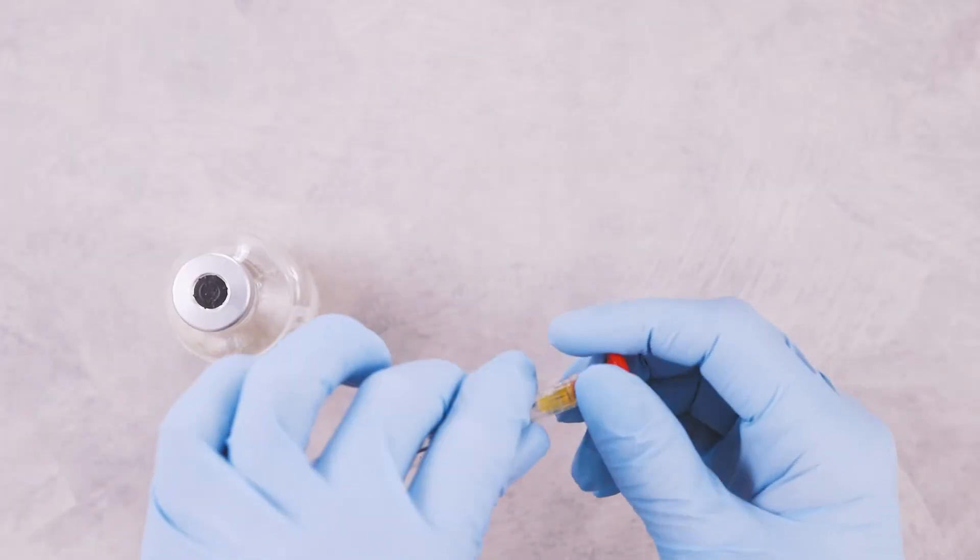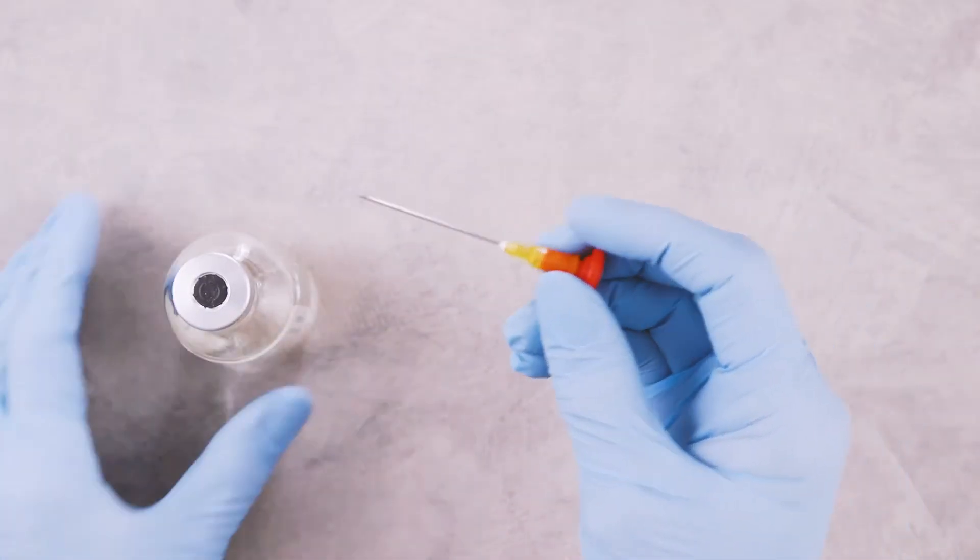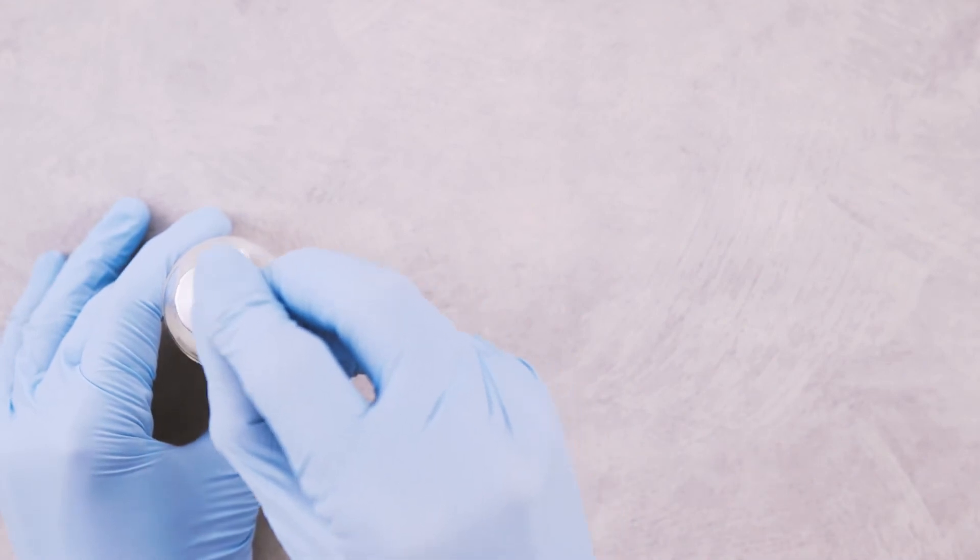Remove the needle guard from the needle using a twisting motion and insert the needle into the septum of the vial.